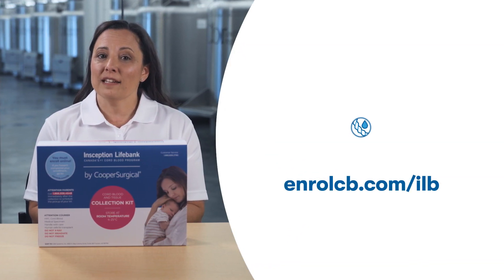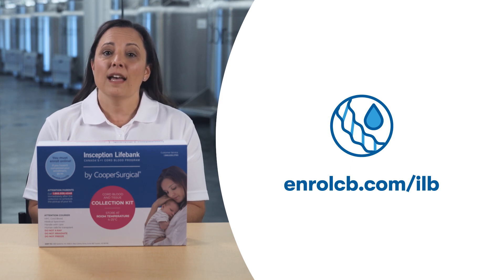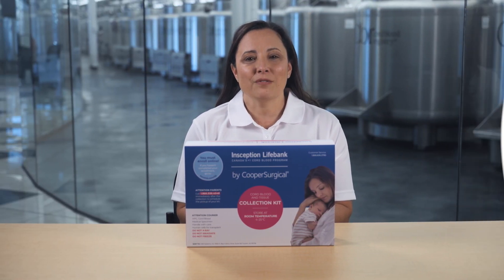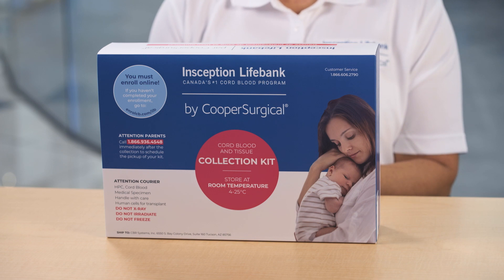If you haven't already, please go online to enrollcb.com/ilb and complete your enrollment. Your kit will usually be shipped to you about six weeks before your due date, but you may have already received it.